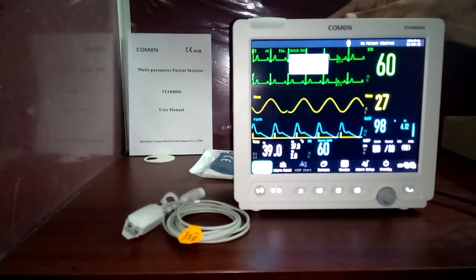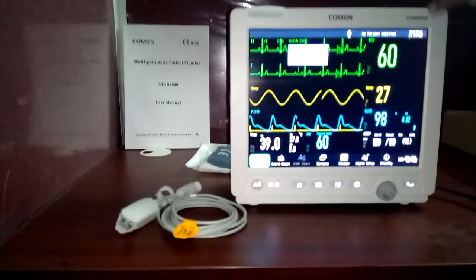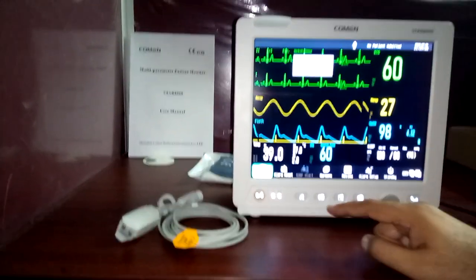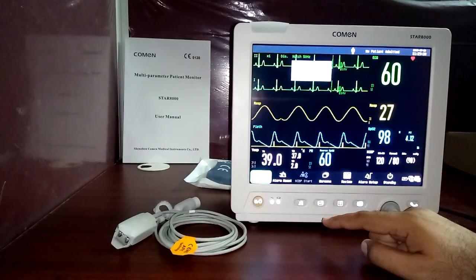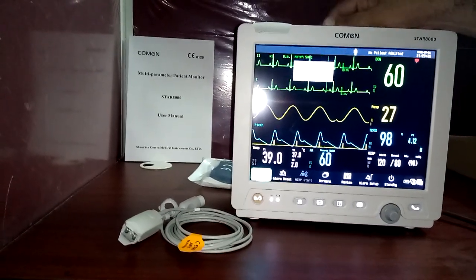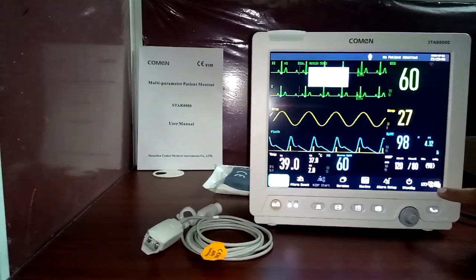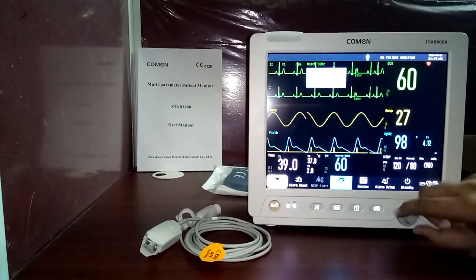Hello everyone, this is the Commonstar 8000 patient monitor. We are giving a detailed demonstration for this monitor. You can see this is a 12.1-inch monitor — the diagonal screen size is 12.1 inches. You can use the monitor by using the knob.